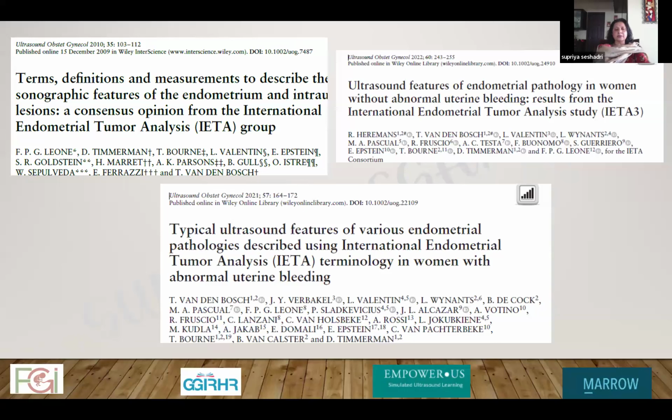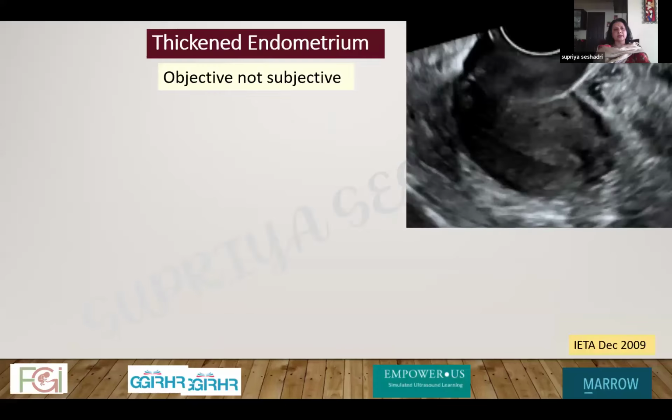There are a lot of articles from them, and I think it's very, very good to refer to them. I use them hugely in my practice as well as in my talks. So thickened endometrium is an objective finding and not a subjective finding. This is a short clip.